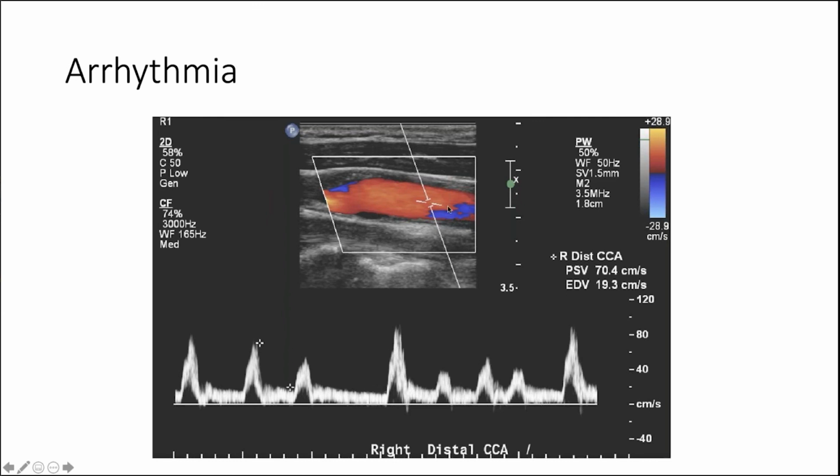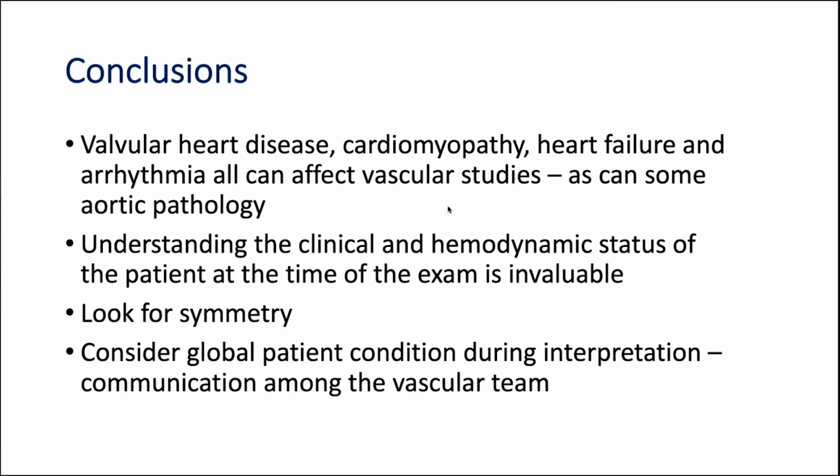Of course, we're looking at the common carotid artery, but this kind of problem can come up again in patients with concomitant carotid atherosclerosis and coronary heart disease. So you have to be careful of selecting the right cycle for your measurements of velocities and determination of stenosis.